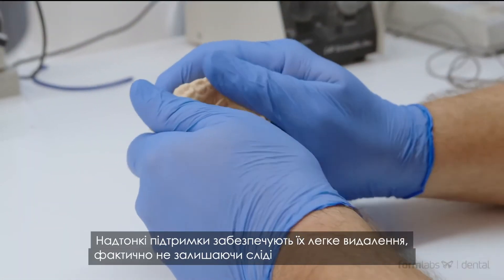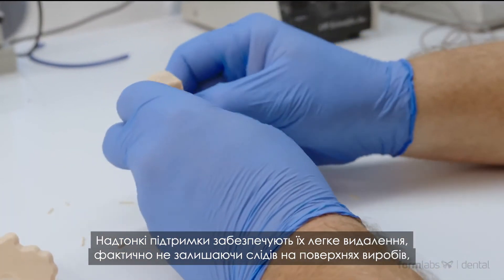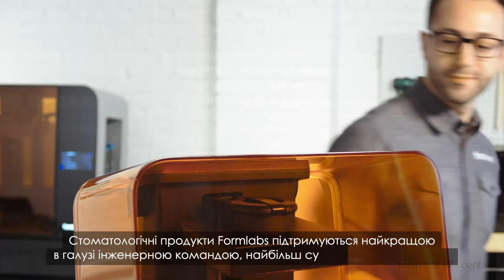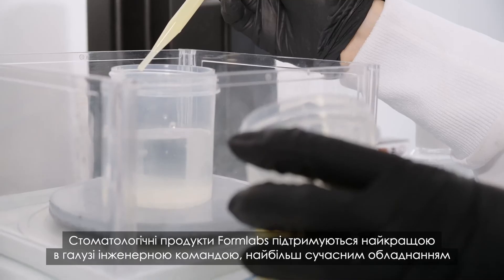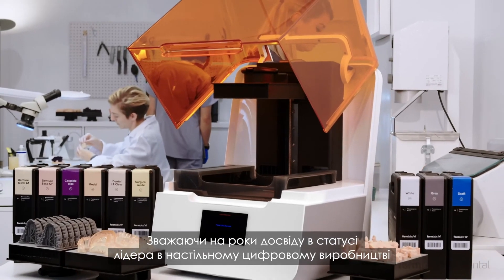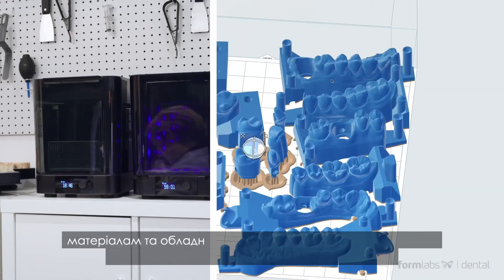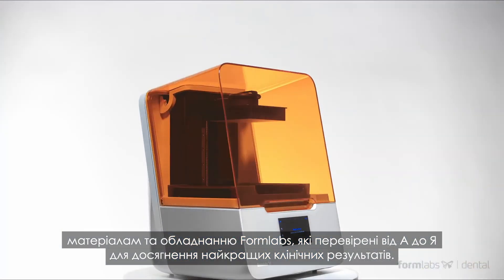Light-touch supports make removing support structures easy and leave virtually no marks on the parts' surfaces, delivering parts that are more accurate than ever. Formlabs' dental product development is backed by an industry-leading engineering team, a state-of-the-art facility for biocompatible materials development, and a team of dental industry experts. And with our years of experience as the leaders in desktop digital fabrication for dental laboratories all over the world, you can trust that Formlabs' hardware, software, and materials are tried and tested from start to finish to deliver the best clinical outcomes.